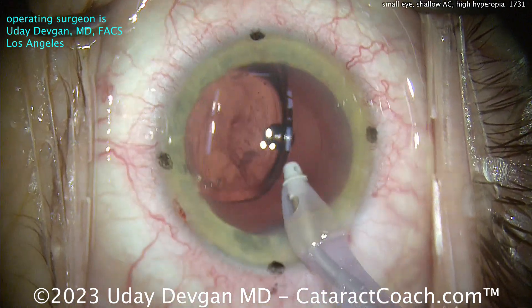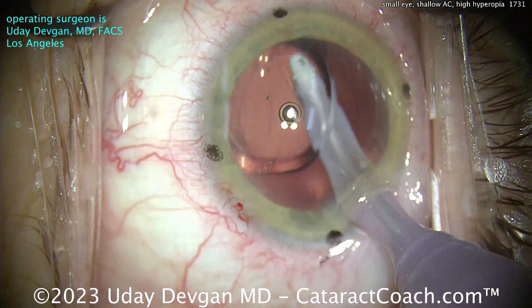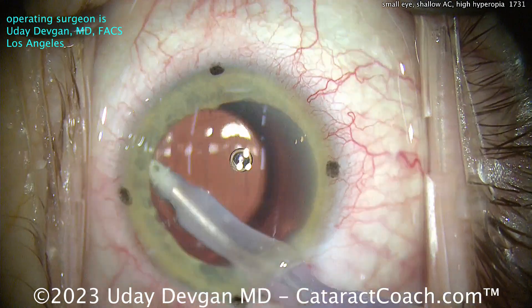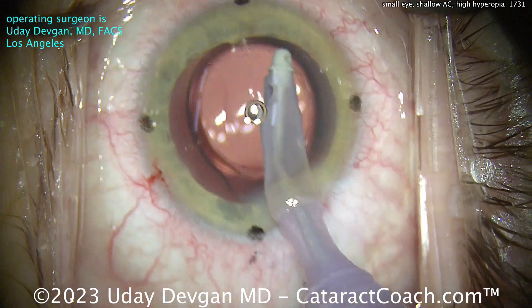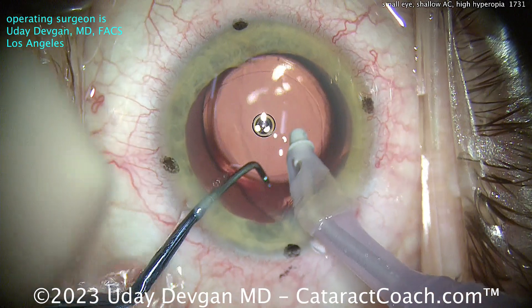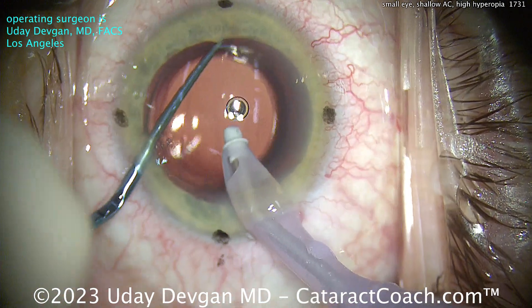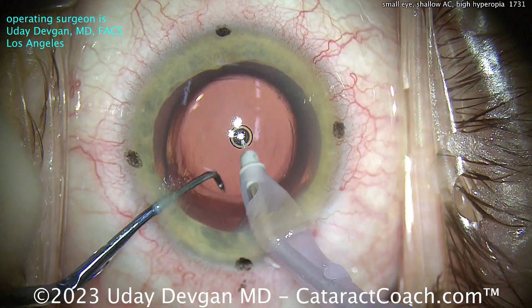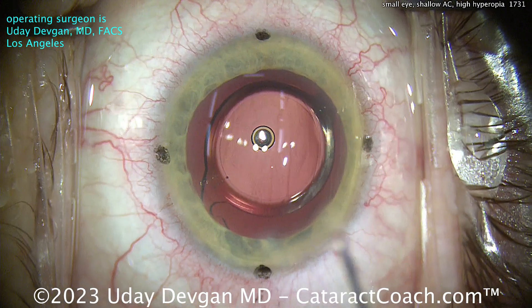Now the lens is in the bag. I/A probe goes behind it to get all that viscoelastic out — we want this lens precisely positioned in the capsular bag. Cleaning the viscoelastic out of the anterior segment as well, with a little capsule polishing and cleaning the undersurface of the anterior capsular rim. I want this to be pristine. Getting the lens rotated — you can see a perfect 5mm capsular rim overlapping the optic very precisely. We have these dots on the cornea marking the steep meridian; we line up the marks on the toric IOL, look at the Purkinje images, and account for parallax. Everything is lined up beautifully.